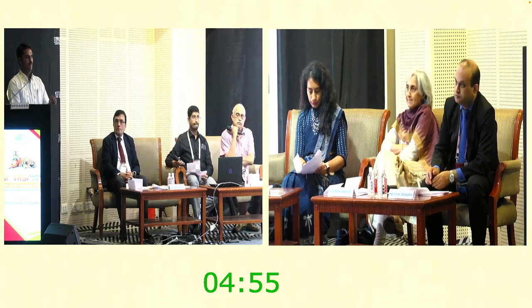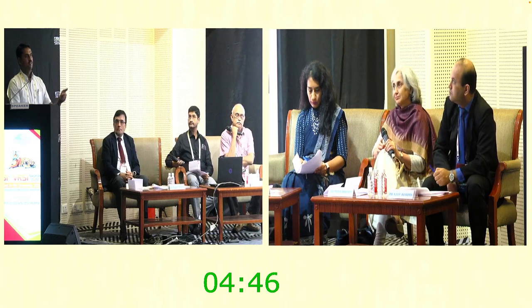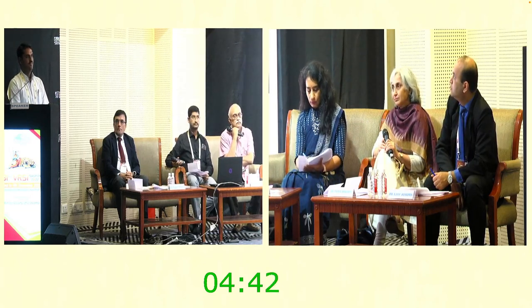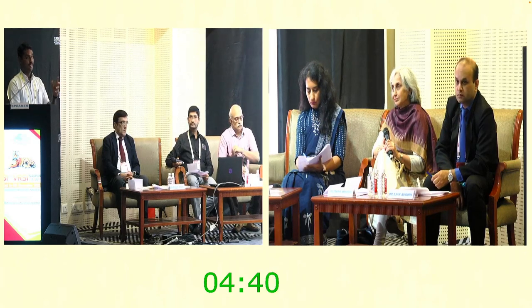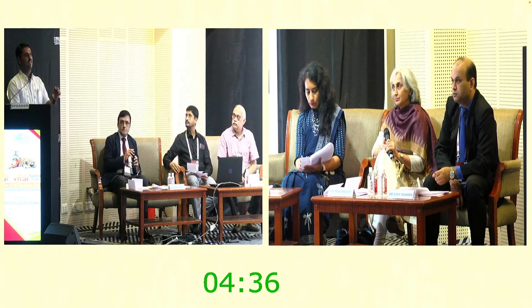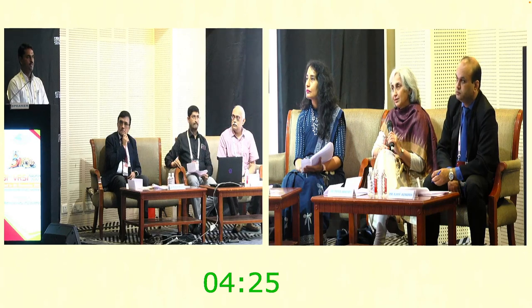So whatever I could do with my setup, I just tried to suture it up, but I couldn't. But then I introduced the Abgel and it was staying quiet. So I just filled it up and left it. Since the second surgery, I don't know whether it was really essential or not. I just wanted to make sure that the sclera is not giving way, because once you remove the oil, it shouldn't gape up. So I went and opened the conjunctiva and the Tenon's to see where it was, but it was already fibrosed. So I just left it as is. I didn't do anything much.